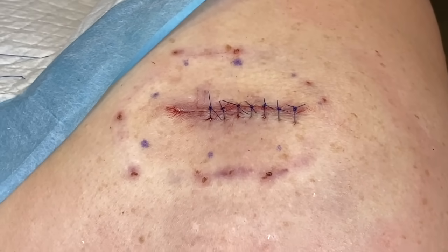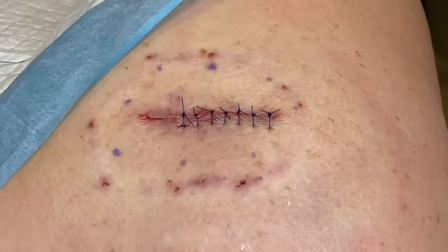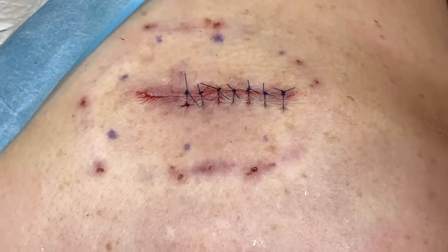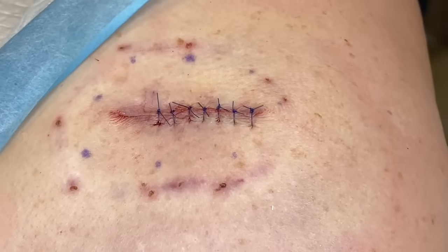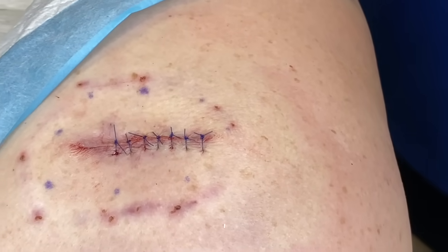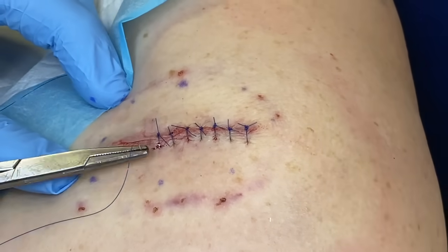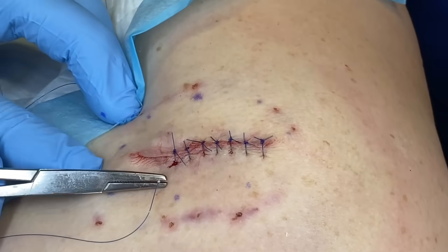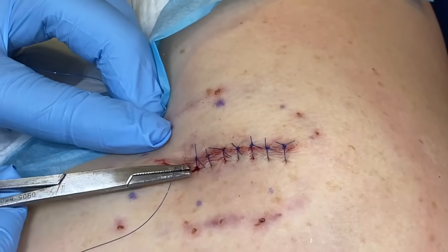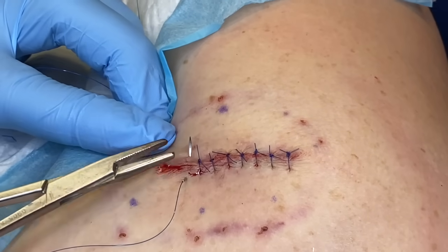You're coming to this side? Yeah. Okay, very good. We're almost done. Yep. Yeah, so that's just right. Yep, position's good. And that was good, so you just re-angled it.